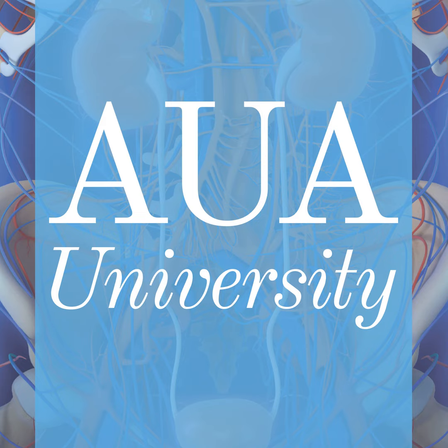So this is an example. You have your plain CT scan of the small pelvis, which apparently looks quite normal. If you use the F18 tracer, you will see this very small PSMA-avid lesion. Going back to the native CT, there might be a zone of sclerosis, which could be everything, metastatic disease or benign disease, but this F18-1007 tracer will give you the identification of a metastatic lesion.